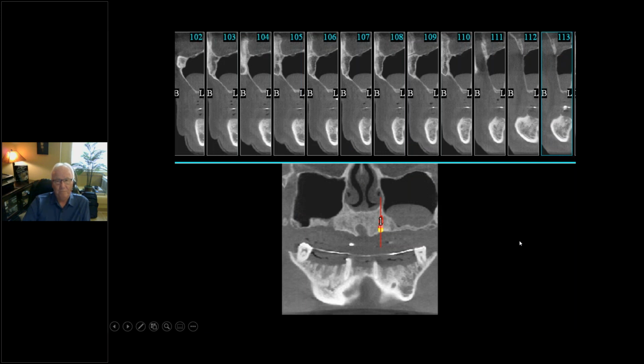Why does it happen? Well, we're task-oriented. Dentists, I'm a guy and I'm a dentist. I want to get the task done. I want to help the patient get my surgical piece done and restored. Well, here's a guy that sent an image to me. This is one JPEG, screenshot of his implant planning. He was all excited about getting new software. And he totally missed all of the inflammatory change in the left maxillary sinus.